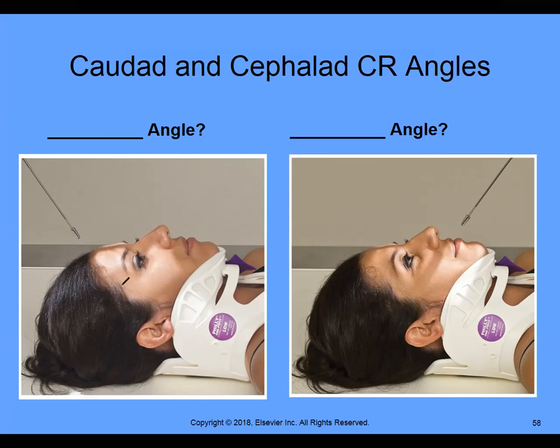This is the long axis of the body. When I'm looking at this picture, this is the X-ray tube right here, and the X-rays are coming.